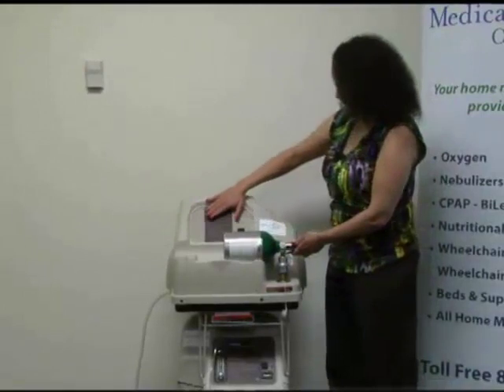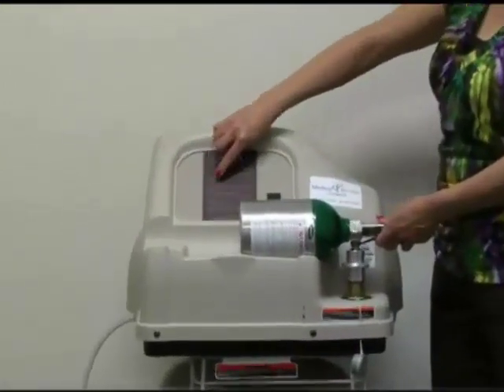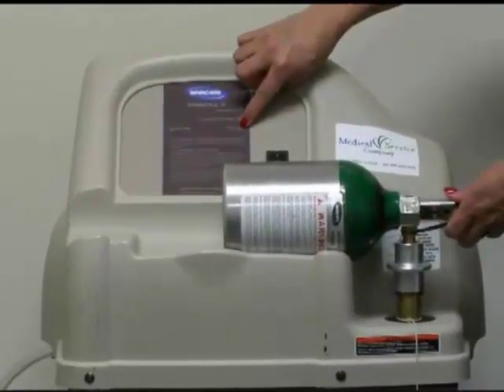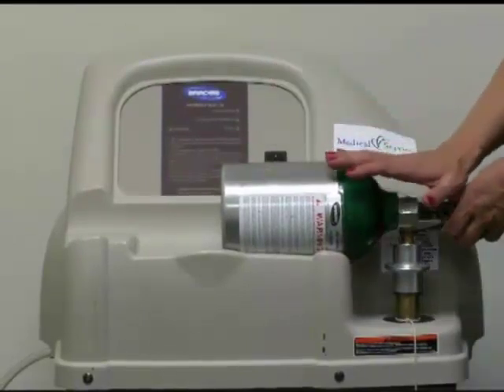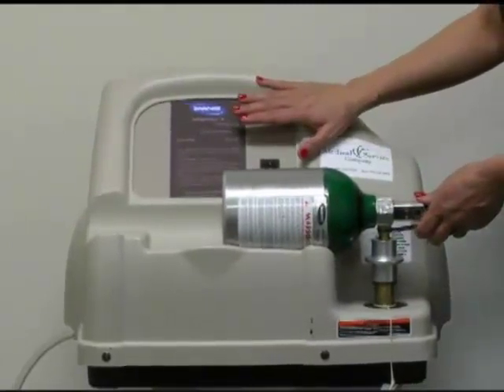Right above the connection you'll see indicator lights. You'll see a light that says it's filling — that'll flash at you. Over here you'll see where it says 'full' and that's a green light, so you'll know you can take the tank off. Keep in mind there's nothing wrong with putting the tank on here to fill, walking away, and coming back later — the unit will shut off on the top when the tank is full.